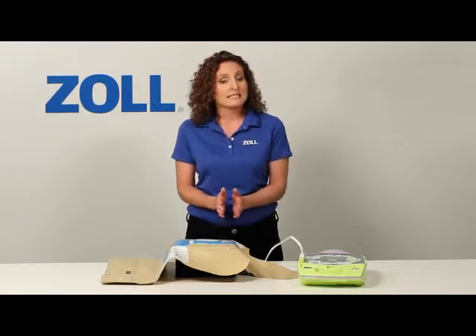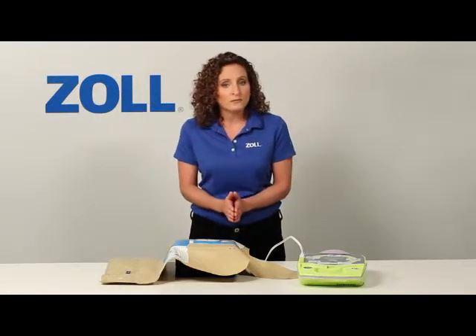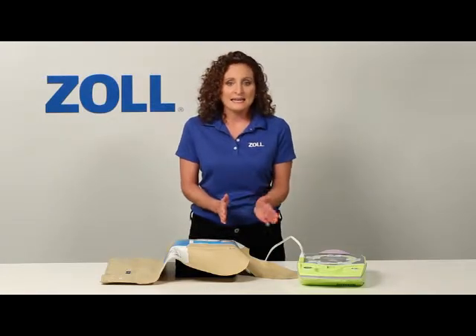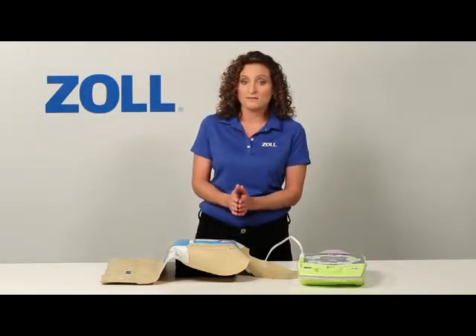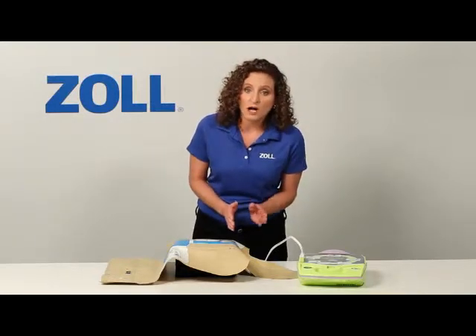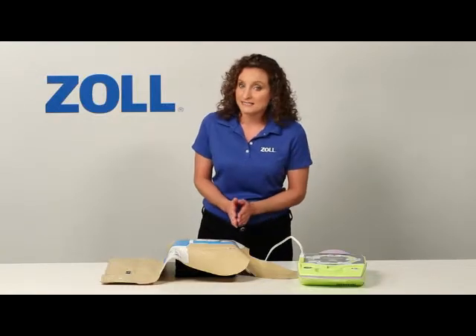As you can see, purchasing the AED Plus gives you real CPR help. It has the lowest total cost of ownership, and it helps in every rescue, not just half the time when a shock is advised. Your rescuers deserve all the help they can get in every rescue. And that's why they need the AED Plus.